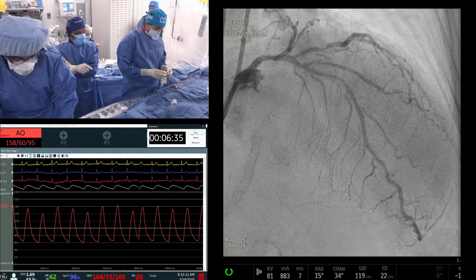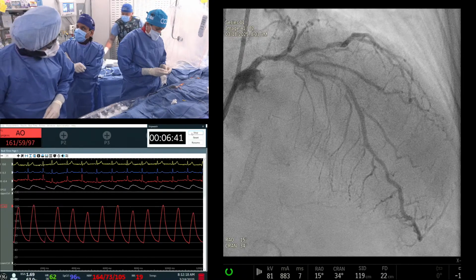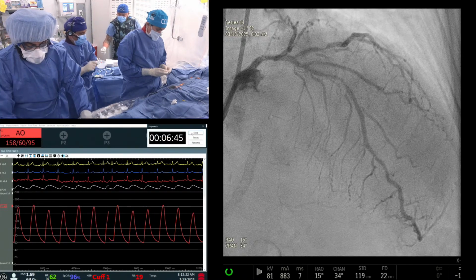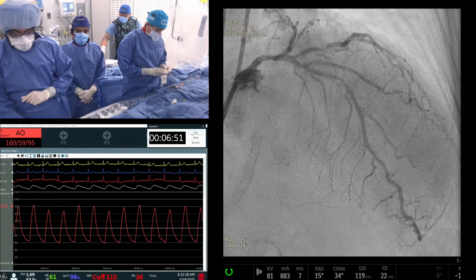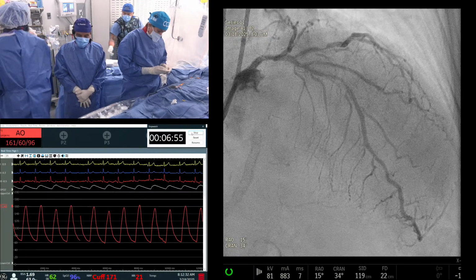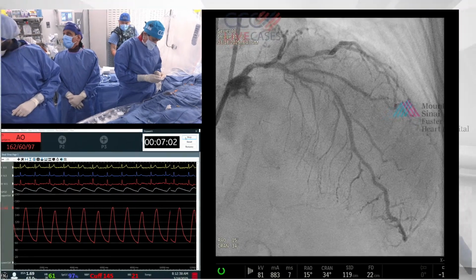There is a new device called Fracture, and we just got approval by the FDA and CMS, and we'll be starting the Fracture trial. Another laser IVL. Mount Sinai will be part of it. I'm in the steering committee, so by year end we actually have three, if not more, IVL catheters available in addition to Shockwave, which we have at present. I polled the audience: unanimously 1.5.